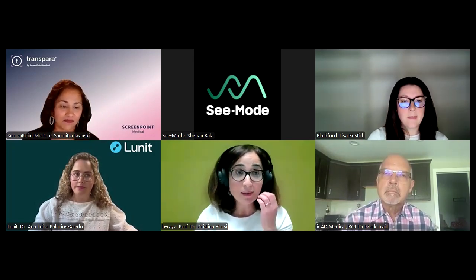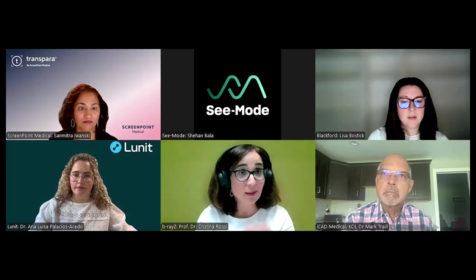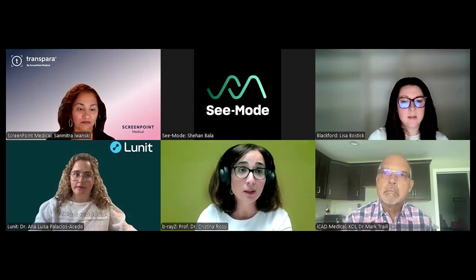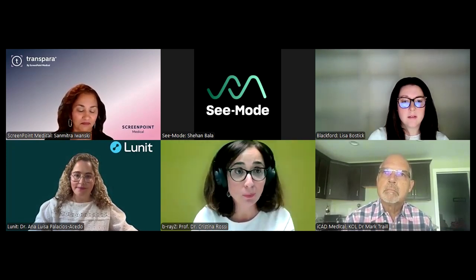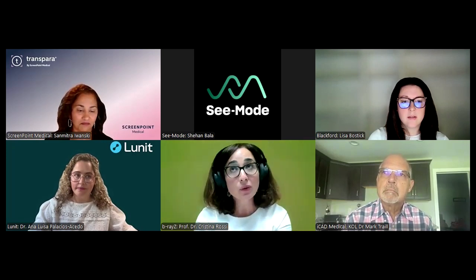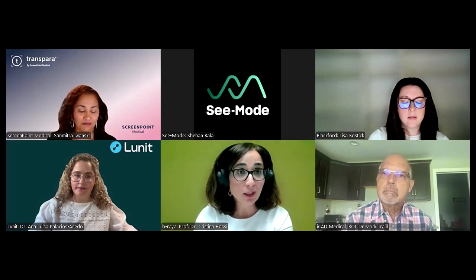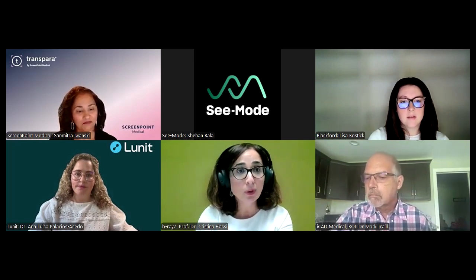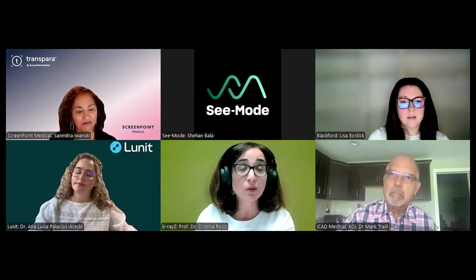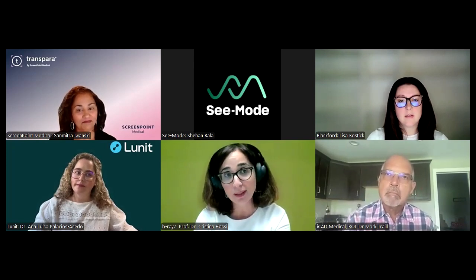So we know the studies done by the colleagues in ScreenPoint and by Lunit, which have shown that the AI could replace one of the readers in some sub-cohort of participants. I think that also a huge opportunity is the one of moving away from screening programs that offer one size that should fit all women that participate.